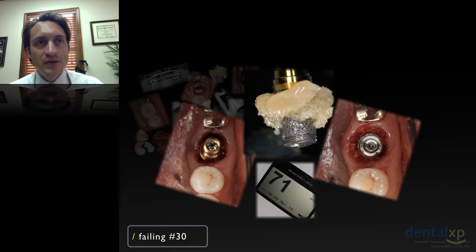In this case, I was using a particulate allograft, and you can see the implant in place on the left. You can see the delivery mount removed on the right, and below the Osstell reading. The Osstell reading was 71, and we know that this signifies very significant implant stability. Again, just look at where the implant is positioned. This is, in my opinion, an ideal position for a molar implant.